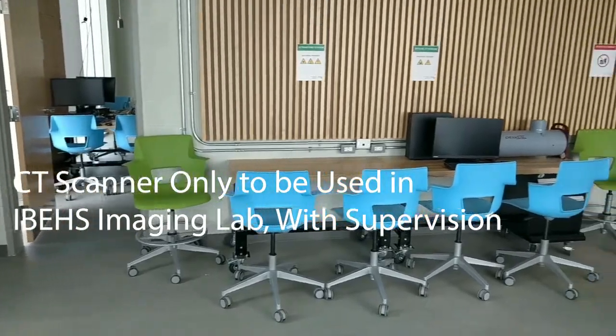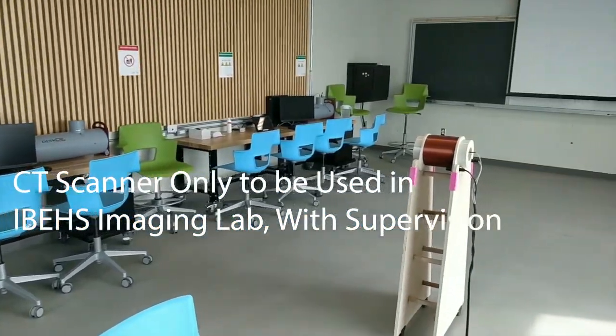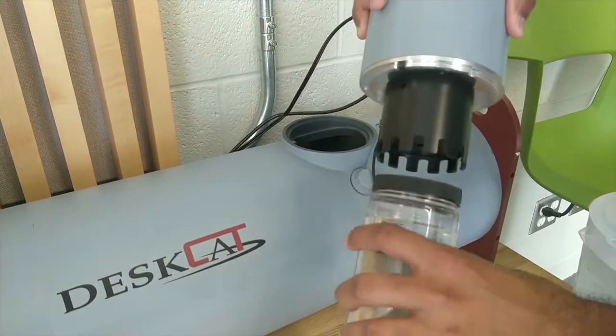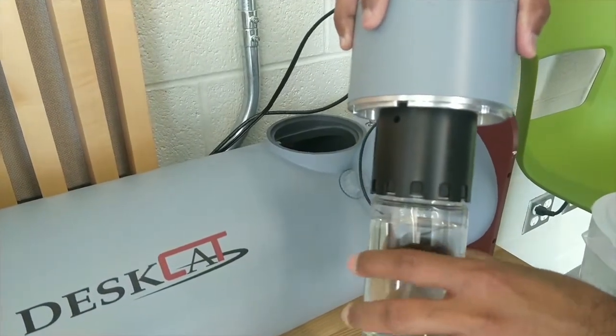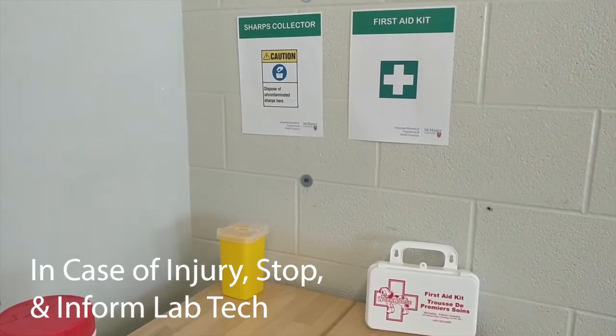Optical CT scanners are only to be used in the IBEHS imaging lab and can only be used when a supervisor is present. Proper handling of this equipment is required in order to safely operate these devices. In case of any kind of injury, stop using the device and inform the lab coordinator immediately.